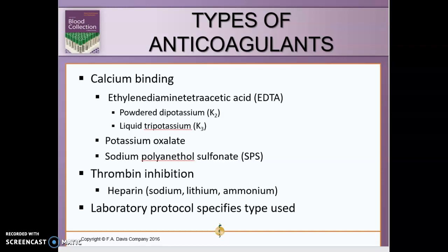The main anticoagulant for the coagulation studies is sodium citrate. So that's one of the main ones. So just remember, the main anticoagulant used for coagulation studies is the sodium citrate.